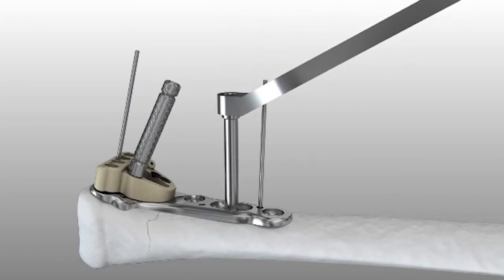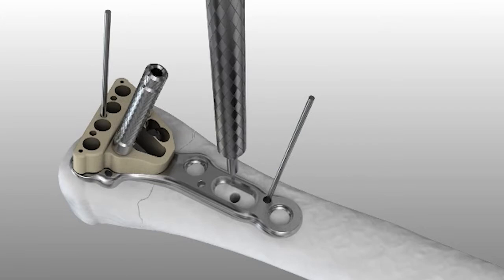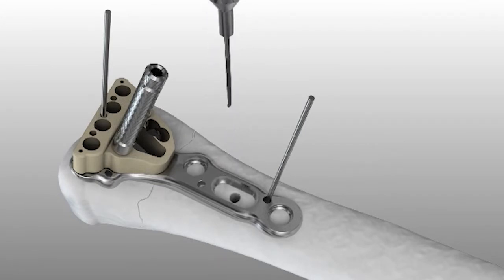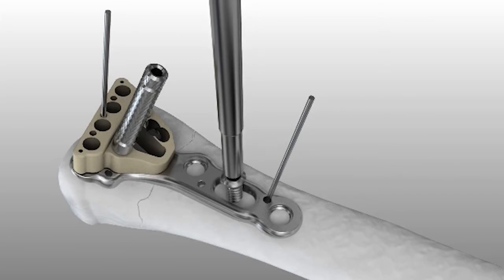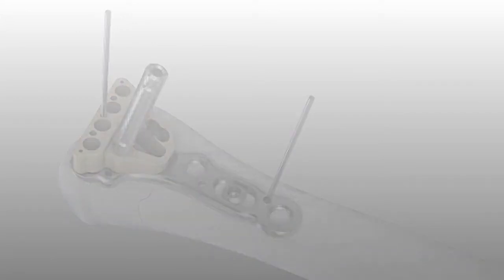Using the 2.8 mm drill and the drill guide, drill to the far cortex. Drill depth is then measured with a depth gauge. Insert the appropriate silver 3.5 mm non-locking screw, taking care that the screw is the proper length. The screw may need to be downsized after the plate has been reduced down to the bone.